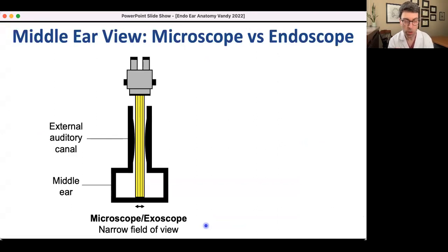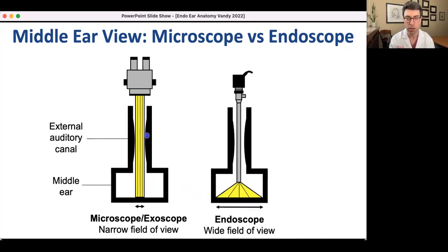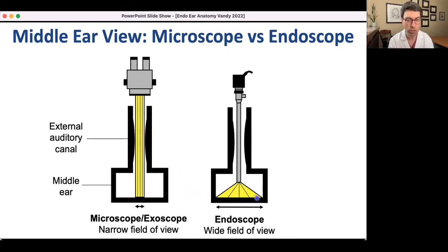A brief overview of the view you get with the microscope versus the endoscope. With the microscope, the view is constricted by the width of the ear canal — the widest view you get is the narrowest point of the canal, so you get a straw-like view of the middle ear. With an endoscope, the optical tip can bypass the narrowest point and you get a very broad, panoramic view, allowing you to see structures in relationship to each other.